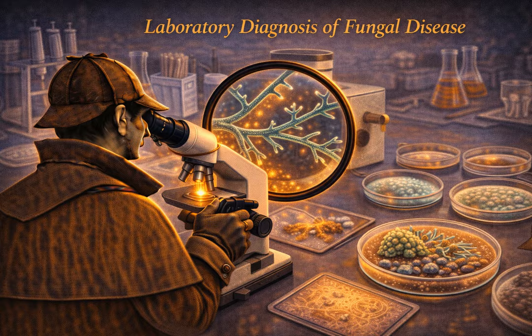Rule number 2 seems to be about quantity. The volume rule. Murray is very strict about this, and Jowett backs this up regarding diagnostic principles. Yes. This is a common frustration for microbiologists. With bacteria, they replicate so incredibly fast, doubling every 20 minutes, that you can often get away with a tiny swab. You drop it in broth, and boom, you have plenty of bugs. Fungi are completely different. They are often present in much lower numbers in the tissue. So a standard dry swab just isn't going to cut it.